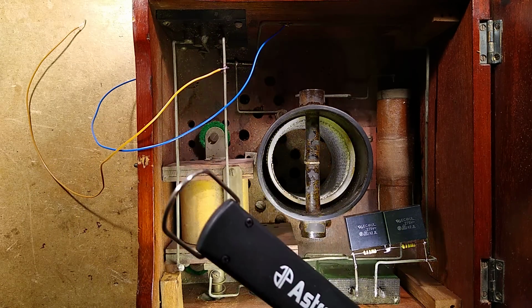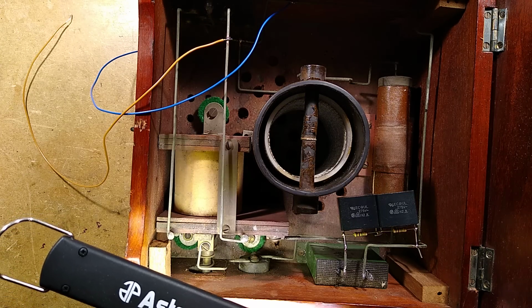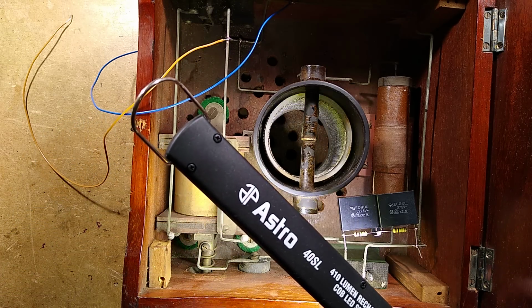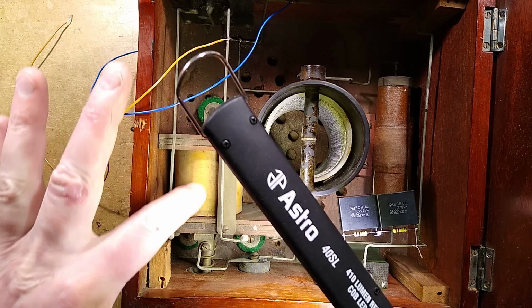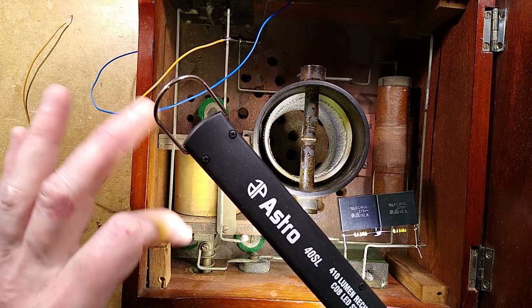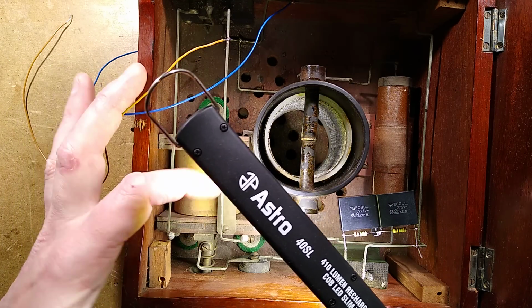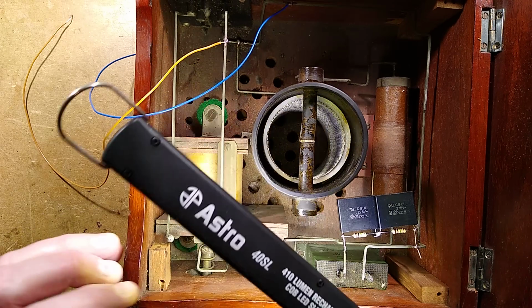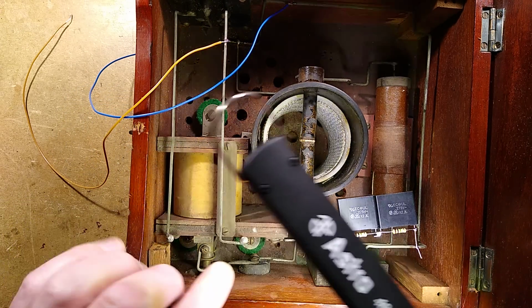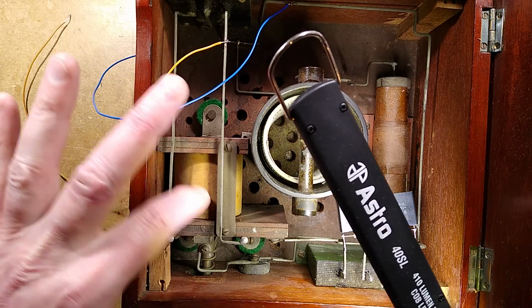When you turn the knob on the side, you may see things rotating down there. You can adjust this backwards and forwards to touch that vibrating contact. And the idea is that when this coil is energized, it pulls in that contact, and breaks the circuit and then releases it and then energizes again. It basically vibrates, making a loud buzzing noise, as you'll notice in a moment, because I'm going to power it up. That then pulses. Well, I'll show you the full schematic afterwards. There's two windings in this.